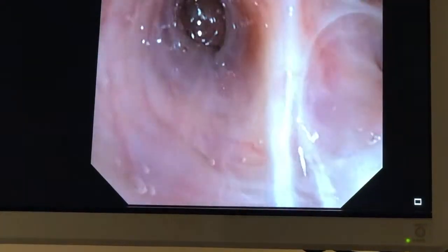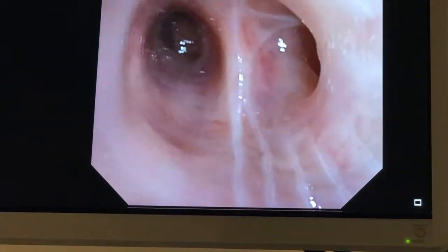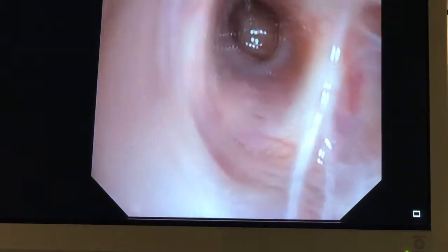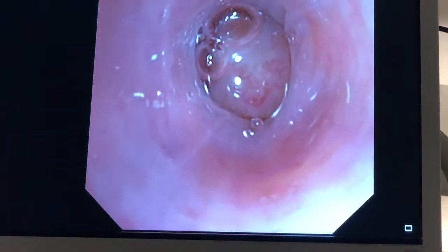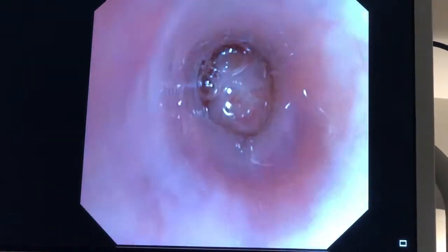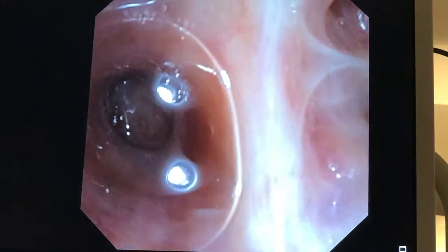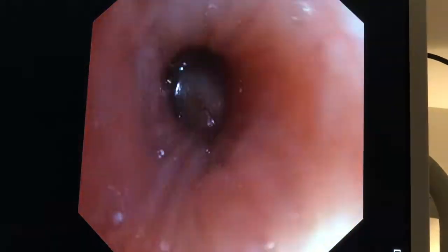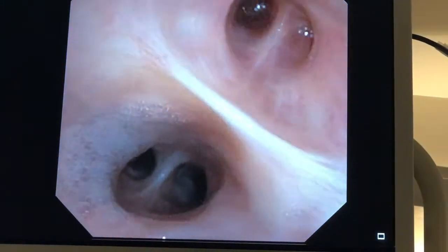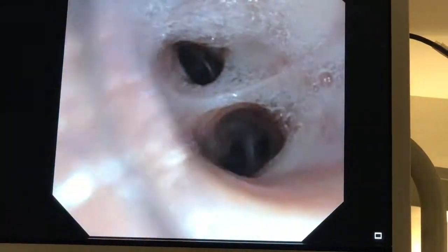Now let's have a look in the lower lobe. This is the apical segment which we're interested in. There's the C bronchus off to the right and the B bronchus in front of us. And there is an endobronchial lesion — looks like an endobronchial tumour sitting there within that sub-segment of the apical right lower lobe, or RB6. So we can biopsy that endobronchially.